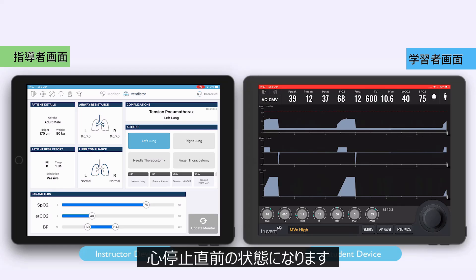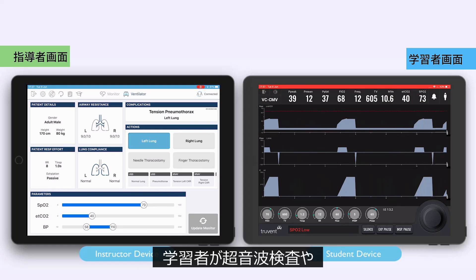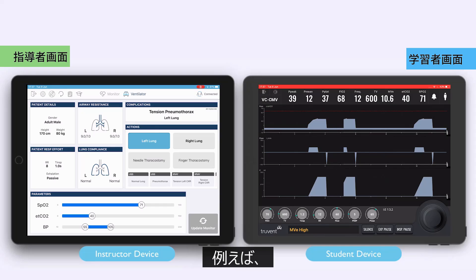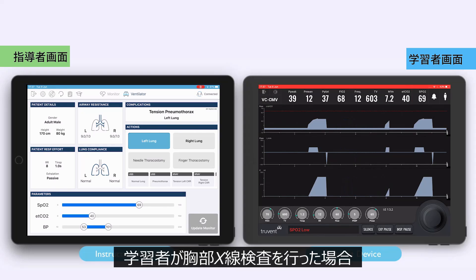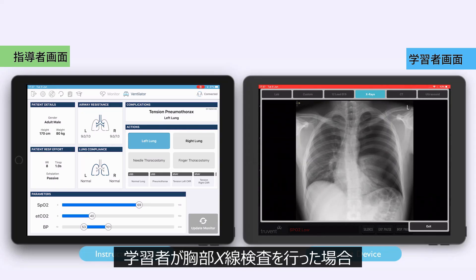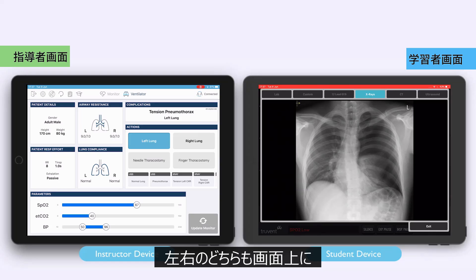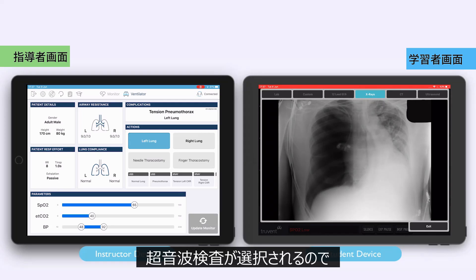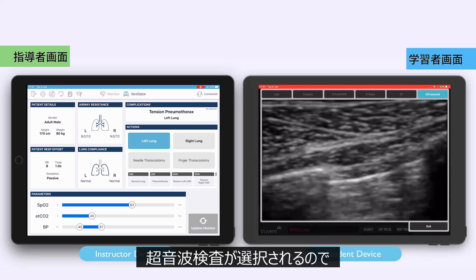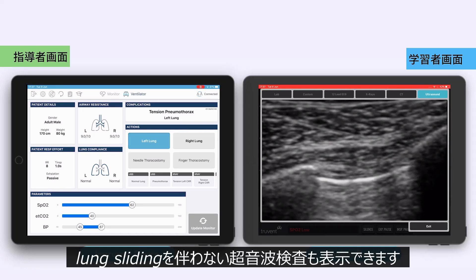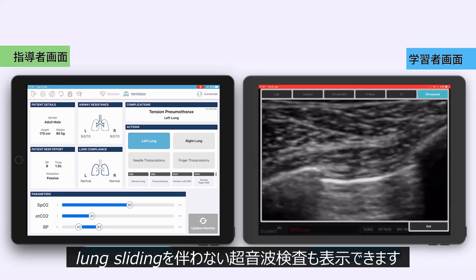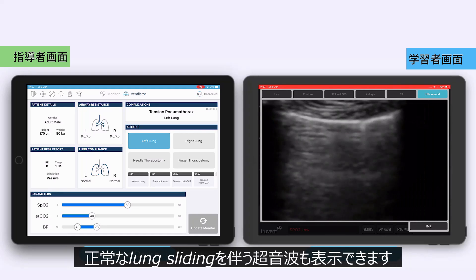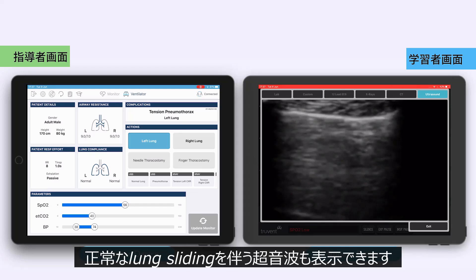If the student performs diagnostic investigations such as ultrasound or chest x-ray, these can be introduced to the scenario. For example, a chest x-ray can be presented on their screen, either left or right. In an emergency situation, ultrasound may be the investigation of choice, so a diagnostic ultrasound with no lung slide could be used alongside clinical assessment. There is also an ultrasound with normal lung sliding to enhance the learning objectives further.